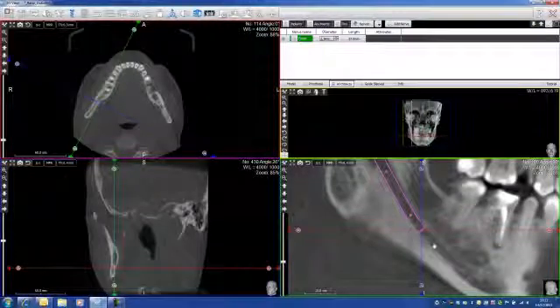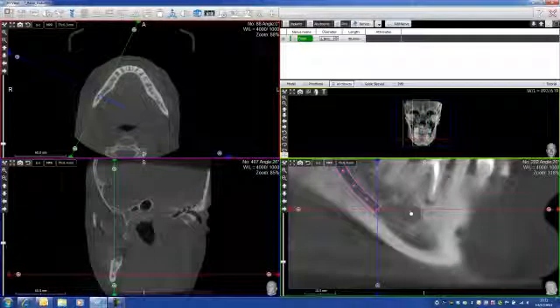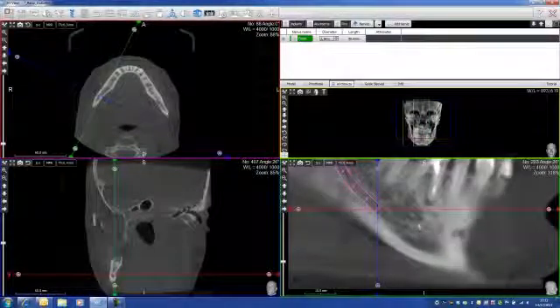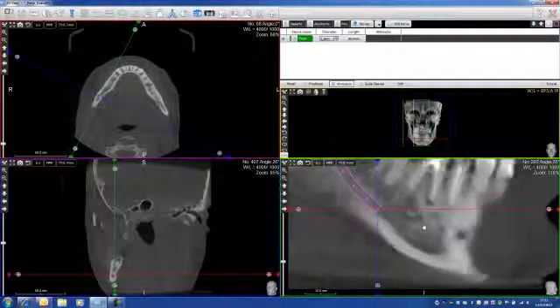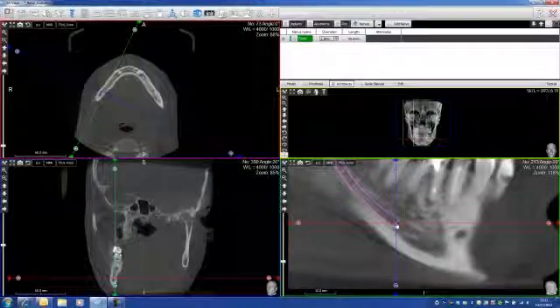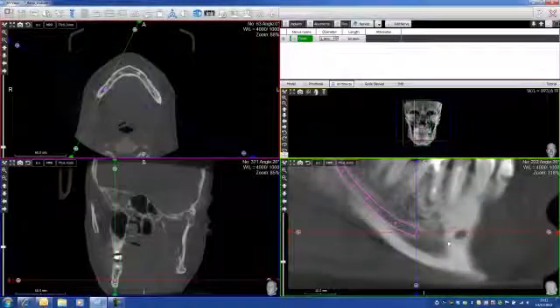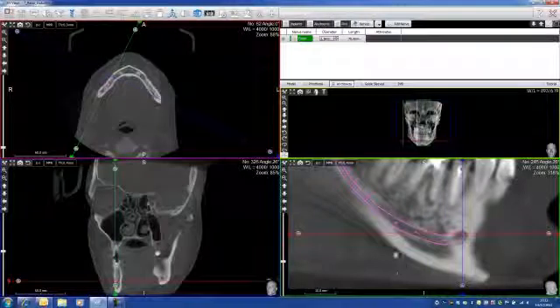There we go. And then I left click again. As you can see here, I can't see it so well, so I can just roll with my mouse until I can see it clearly. There we go. I can see the tracking now. I click, I click, I continue clicking until the end. My mandibular canal is traced.